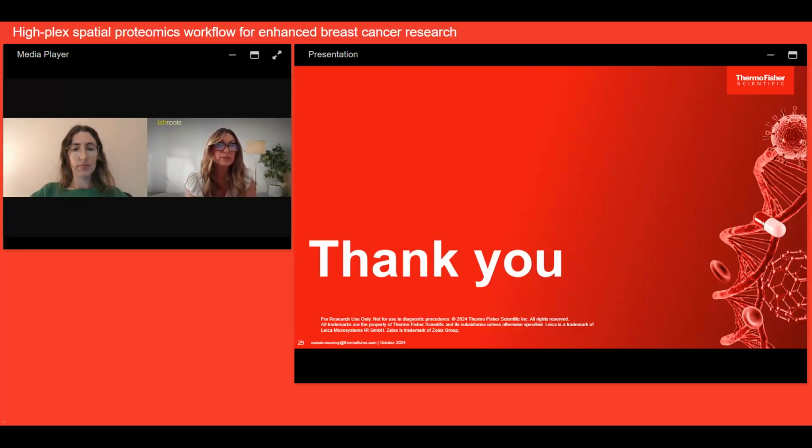Can the 8 dyes be removed from the tissue for reuse with another set of 8 distinct antibodies? Sure. So for the Aluora spatial amplification reagents, no, they are covalently bound to your tissue. So once you put down the 8 fluors, they will be there. So you can't do any kind of cyclical staining, kind of like some of the other platforms.